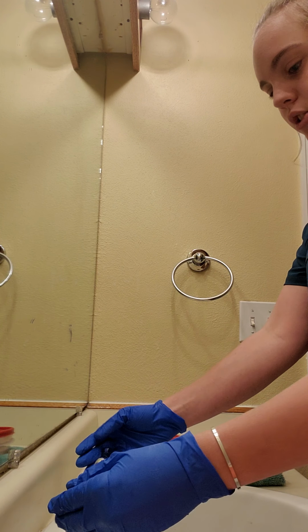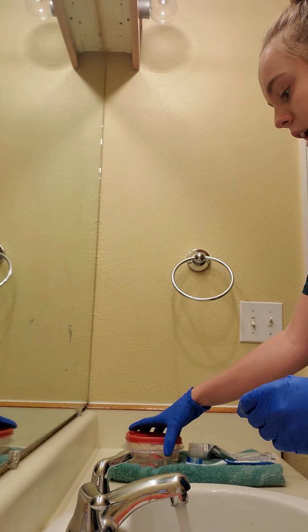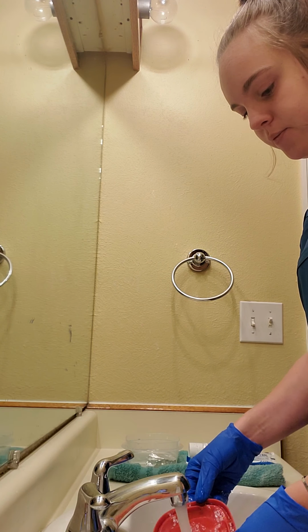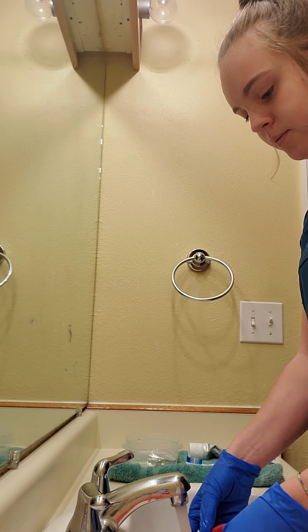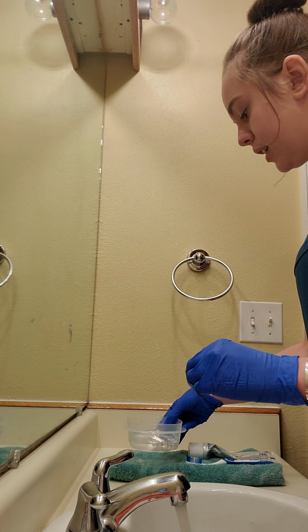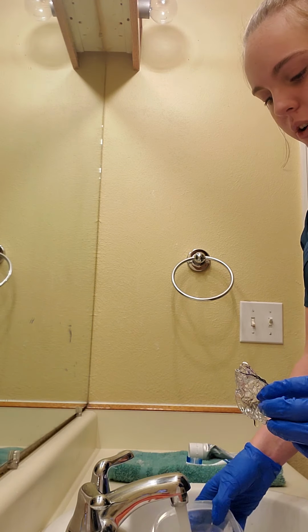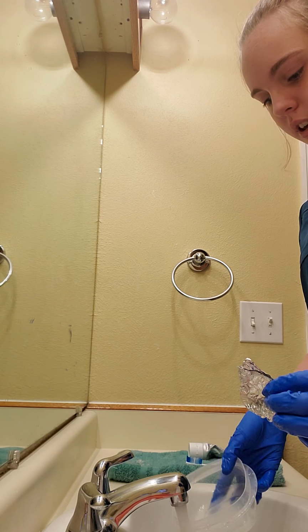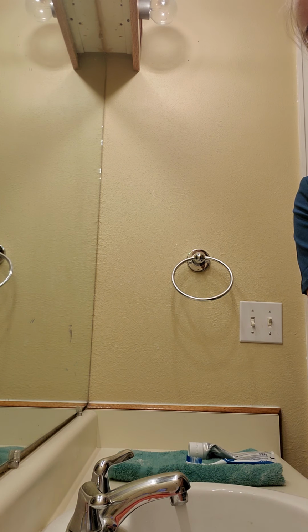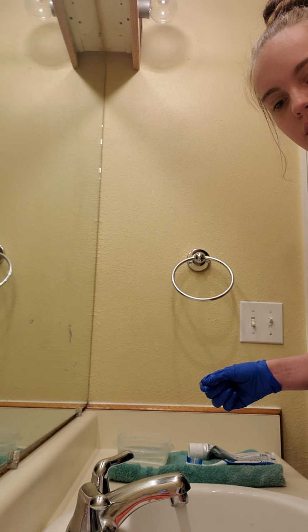Okay, I would next turn on both faucets. I would take their dentures and take the lid off. I would rinse the lid first and set that on my barrier towel. Next thing I would do is I would take the dentures out. I would dump this water, rinse it, and then fill it up and set that over. I'll put it back over here, and I will set the dentures down on the barrier towel.